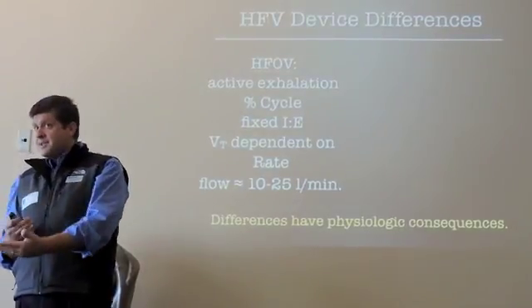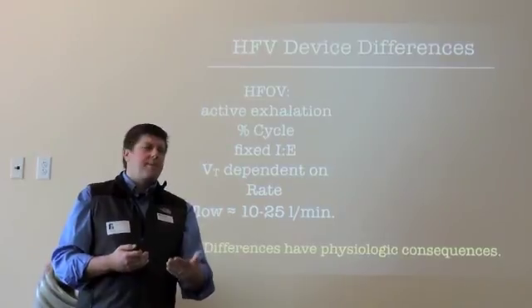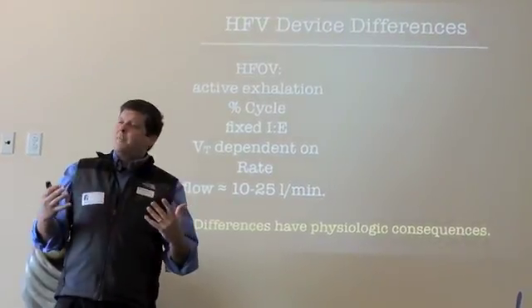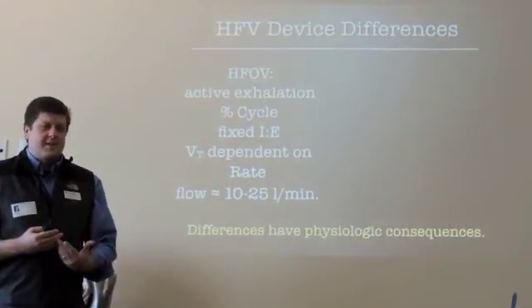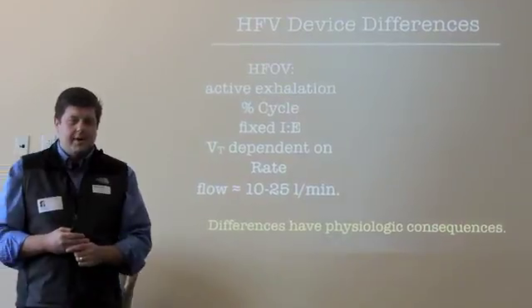If it's a homogeneous type disease process, if it's your typical little preemie RDS type kid, that works pretty well. But when they start to become overinflated and gas trapping, and maybe they develop an air leak or two, maybe we need some longer exhalation times. And so sometimes that doesn't work quite as well.